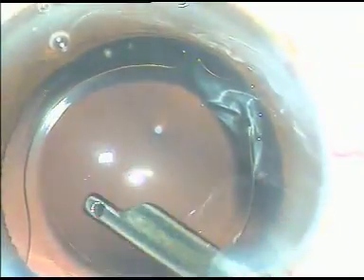If we do a mini-rhexis and then enlarge the rhexis, the main challenge of an intumescent cataract is taken care of. The case is over. Thank you very much.